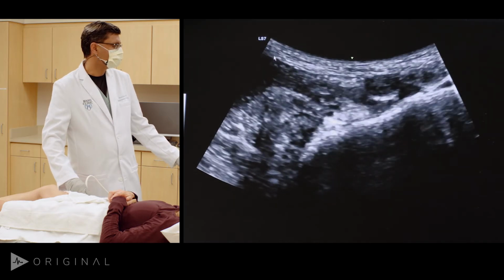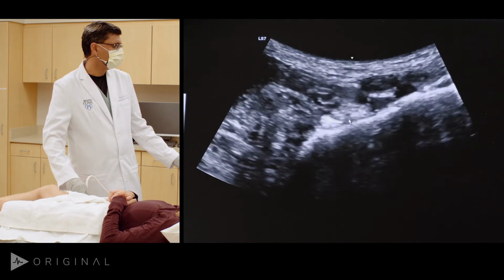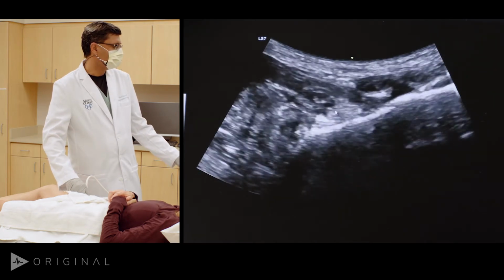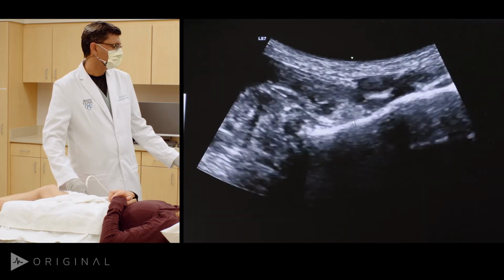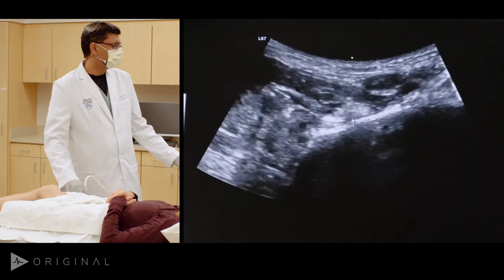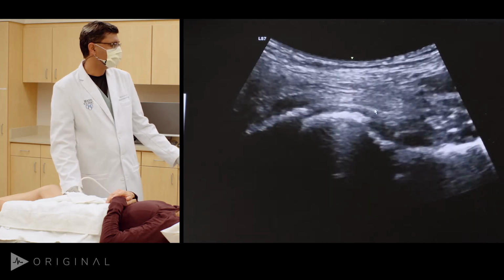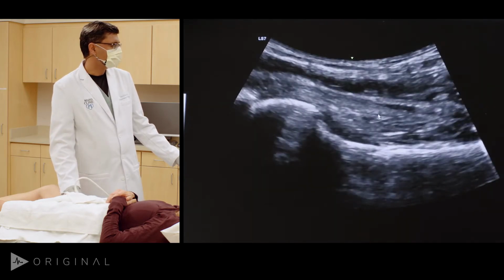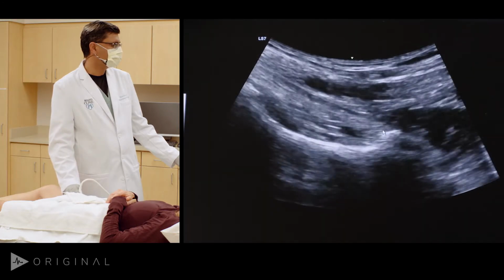Generally, you can come from the lateral side, get through the muscle, and right under the tendon so that you can inject fluid in the tendon sheath and in the bursa. Both of them can be pretty accurately done in a transverse way. Now, when you go long on the psoas tendon, as it goes deeper for its insertion, you get a lot of anisotropy because of the angle at which it's going.